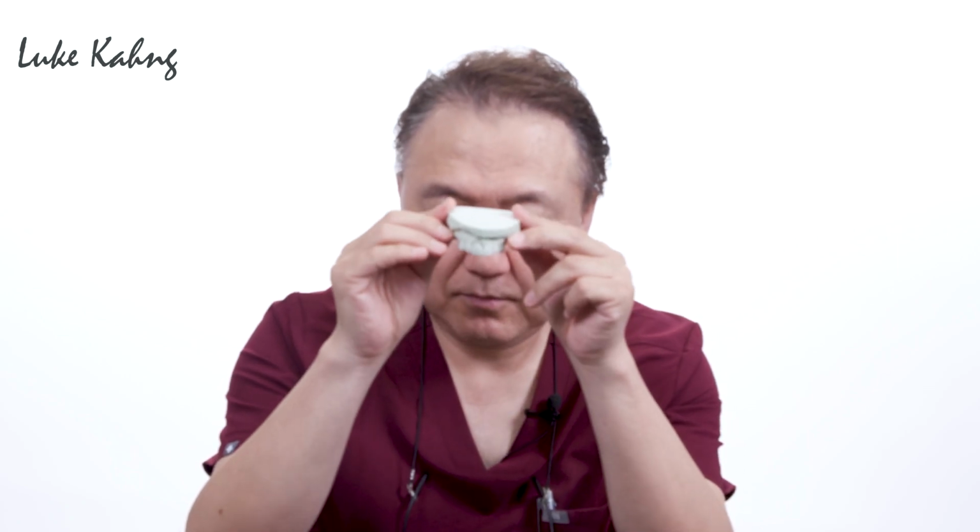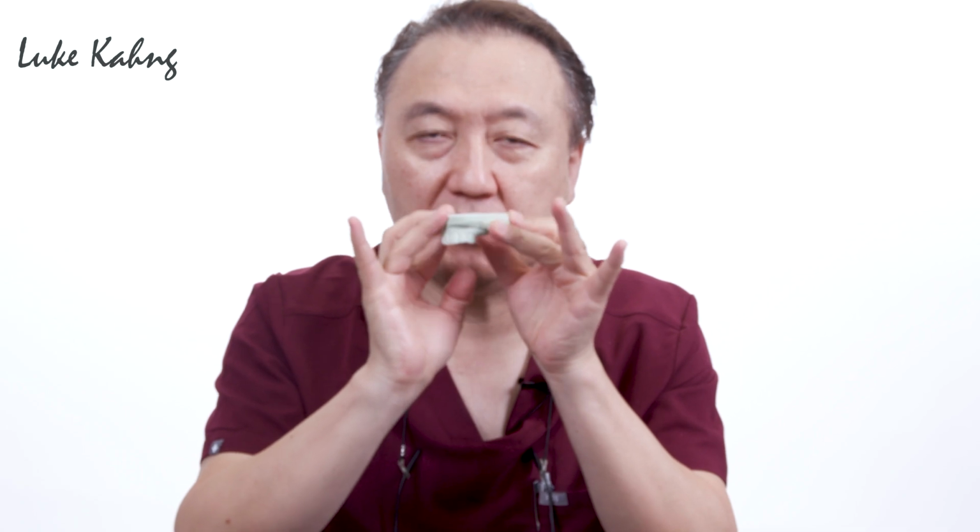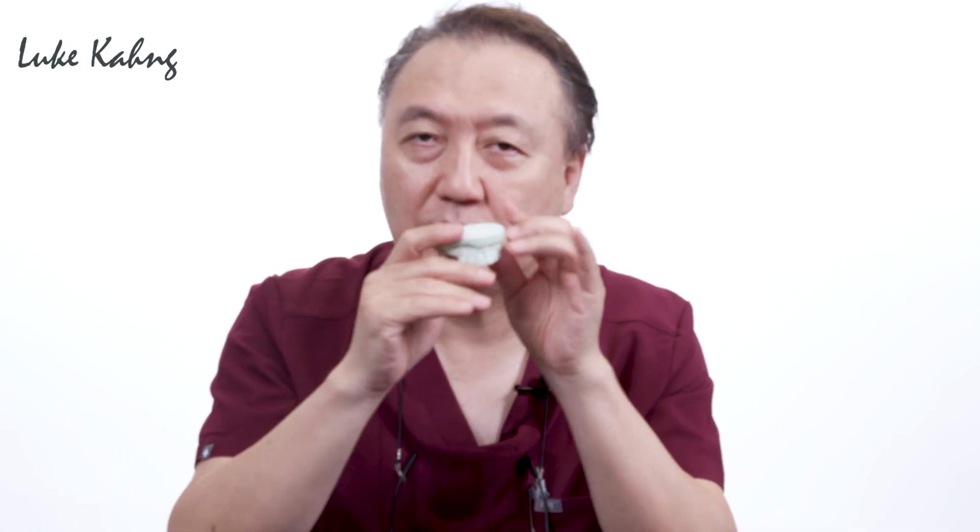So this topic is this. This one is about a patient who has about 7 teeth, but is partially dentulous; there are no teeth in the back. There's no teeth. But the people don't want a bridge, and they don't want an implant, probably because of money. People don't want to make the partial because we have to make this. So here is the solution.